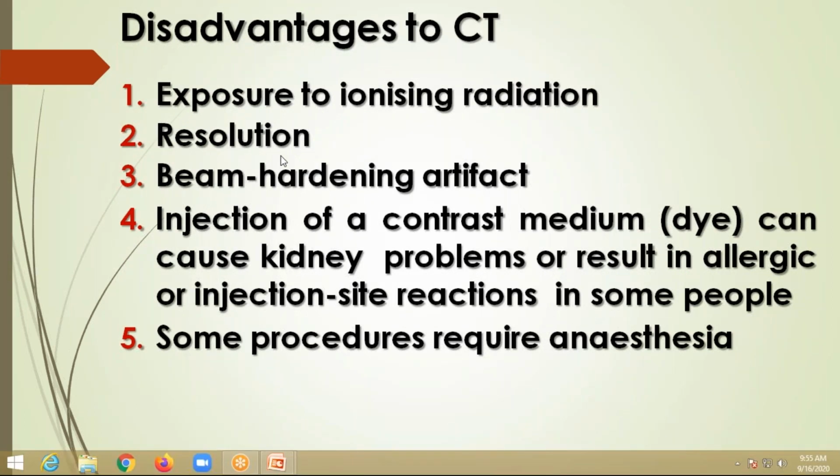And then the resolution of the image is very poor compared to MRI, and then beam hardening artifacts I have shown you before, and injection of contrast media can cause kidney problems. Actually in CT sometimes we will use contrast media, sometimes oral contrast, sometimes IV contrast, and it can cause some renal problems, some acute allergic reactions, and an injection site reaction in some people.